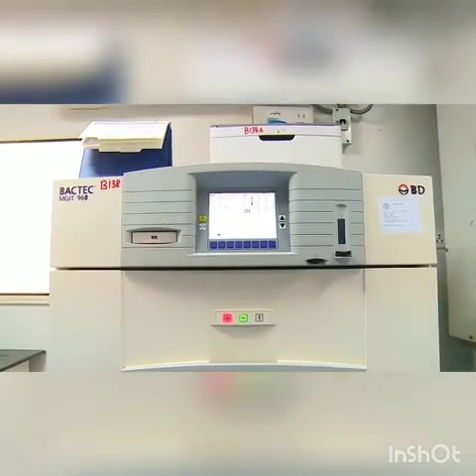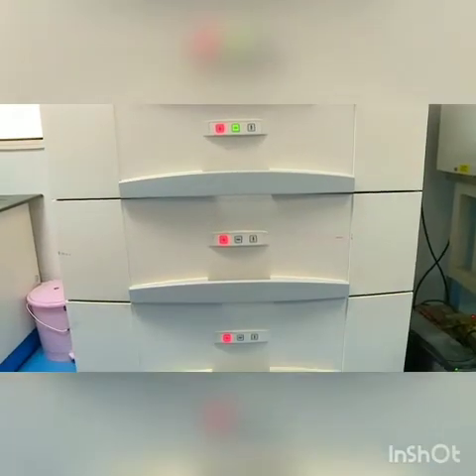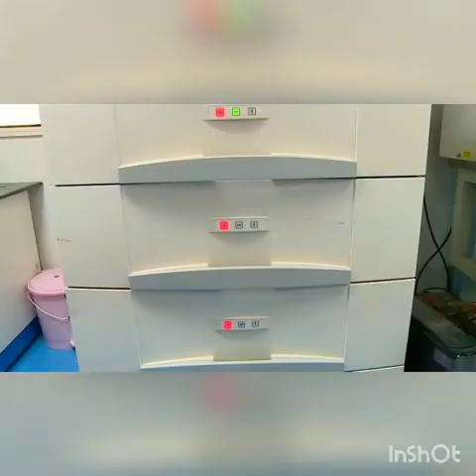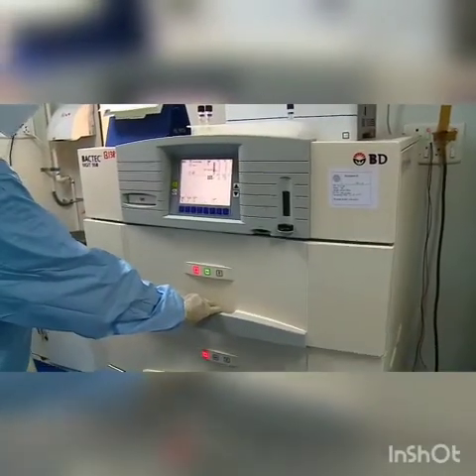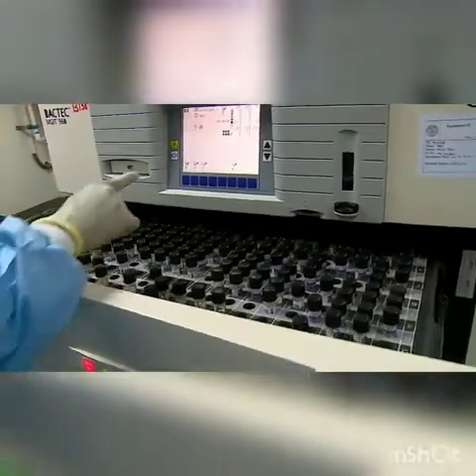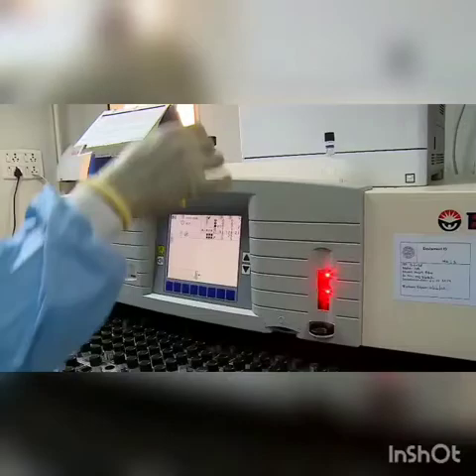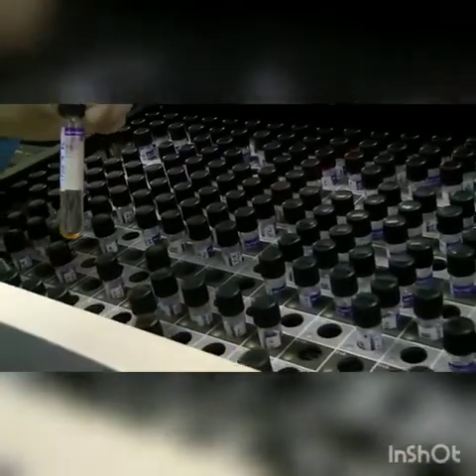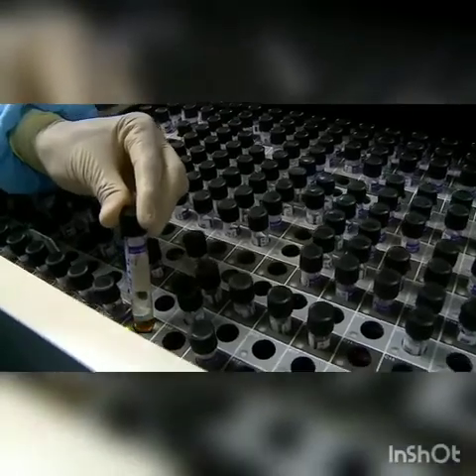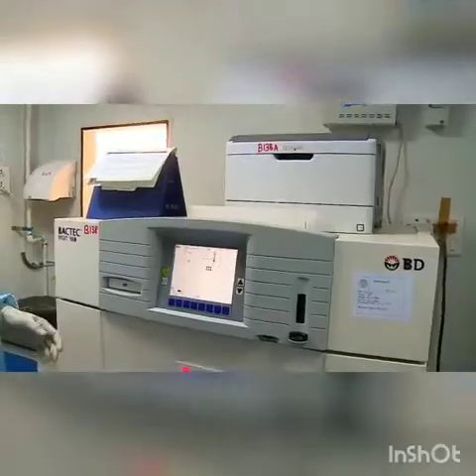This is the BACTEC MGIT 960 system with a display screen that has user-friendly icons. The system has 3 racks, each capable of holding up to 320 tubes. One of the racks is pulled out, the insert button is pressed, and the scanner is activated. The barcoded tube is scanned and immediately the system indicates an empty slot with a flashing light sensor where the tube has to be inserted, and the rack is closed.